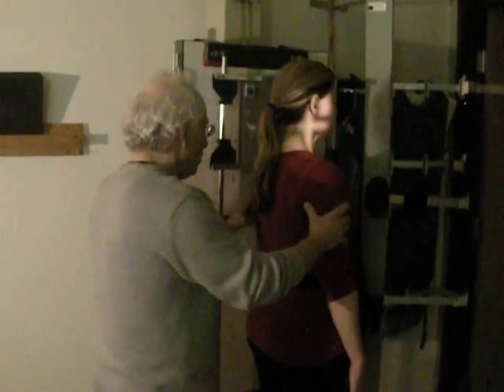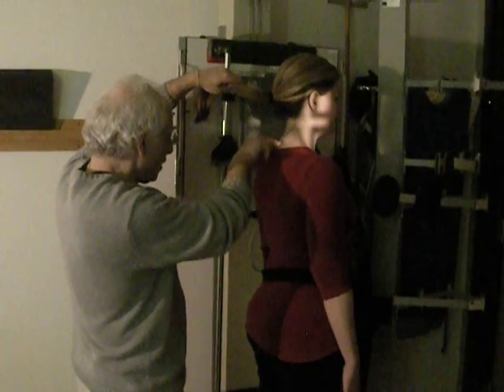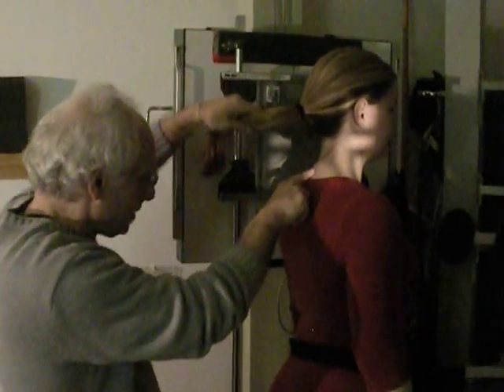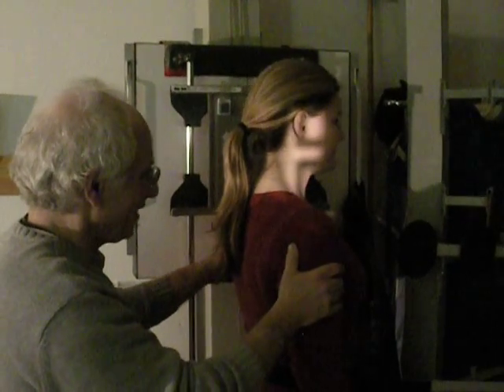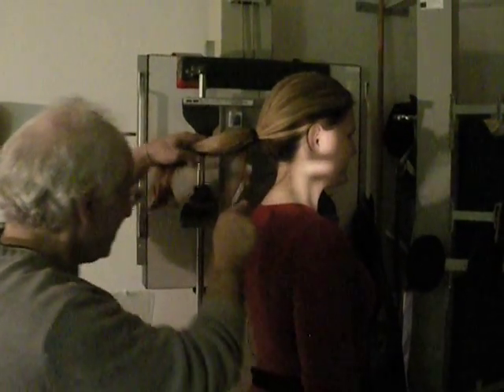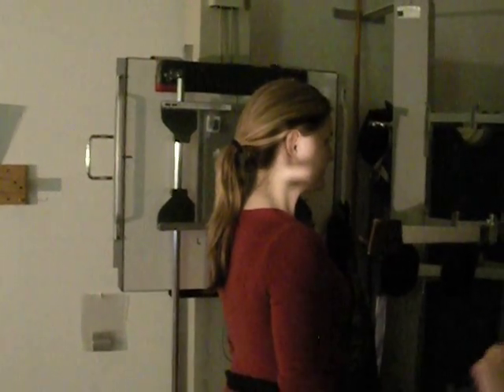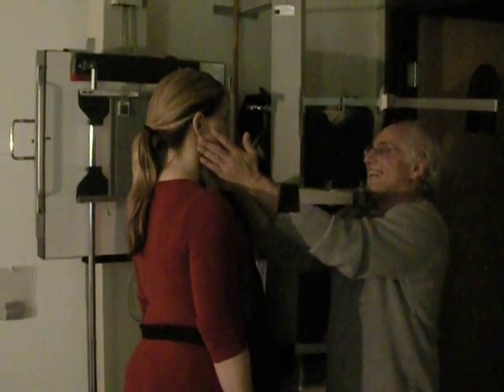And the idea of this is to pull her shoulders down and give us a better look at the C7-T1, and I'm using my finger in the shadow on the spinous process to make sure that it's being included. The spine is in the back. If you're centered over the face like this, you're missing it. Okay, the spine is in the back. So I see it here, and I walk around the front of my patient.